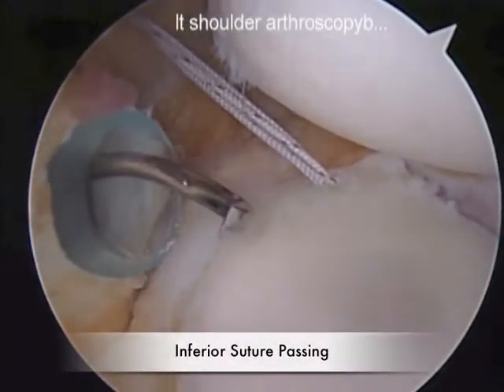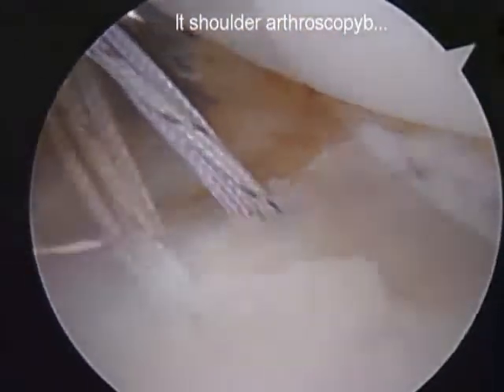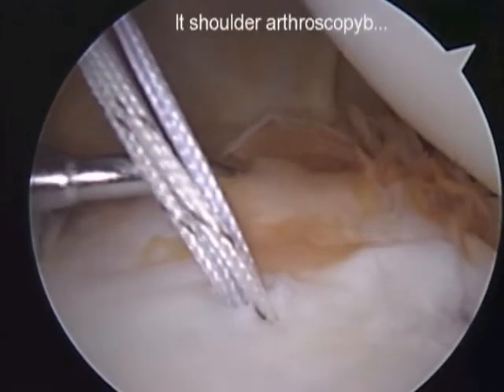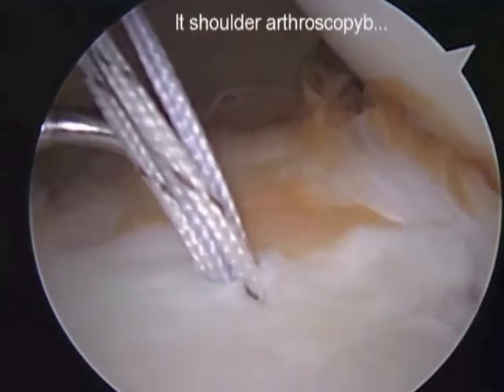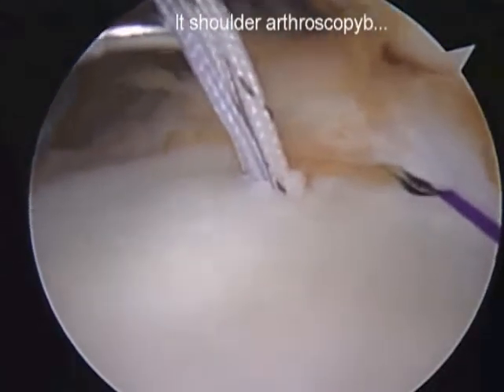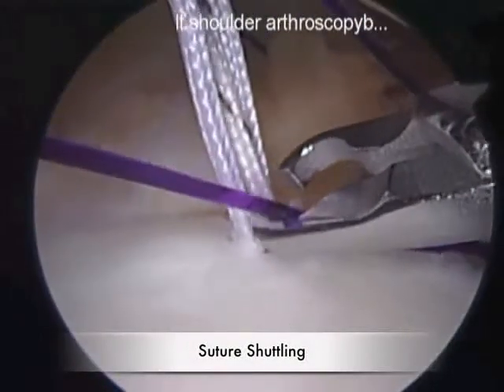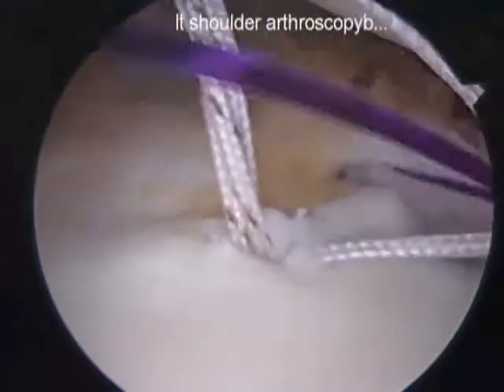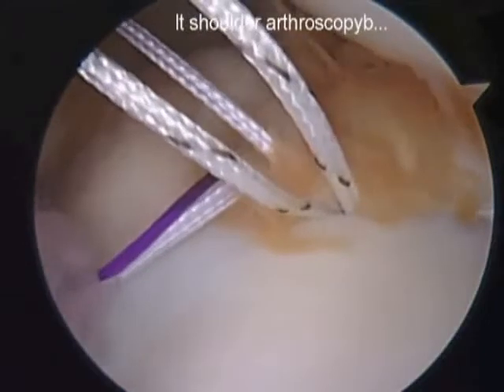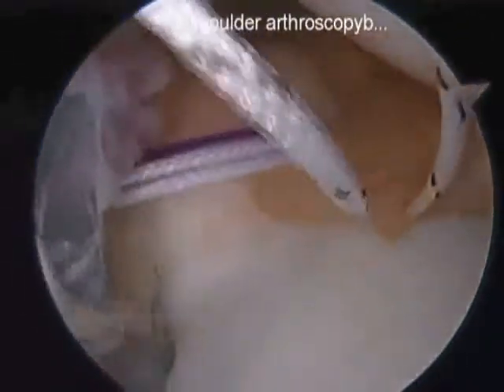An 8 mm cannula in the posterior portal is used to pass the initial inferior stitch. Great care is taken with the first pass due to the proximity of the axillary nerve to the inferior capsule. The first suture pass facilitates reduction of the inferior capsular volume. A bite of the inferior capsule is taken, and the suture passer exits just inferior to the labrum. A standard shuttling technique with a PDS suture is used to pass the first suture back through the capsule.